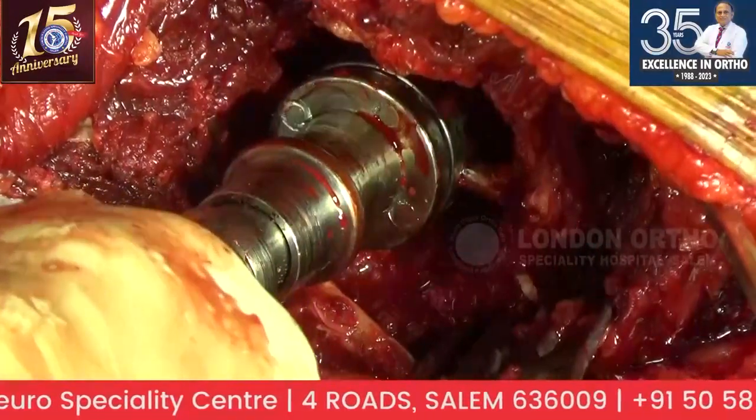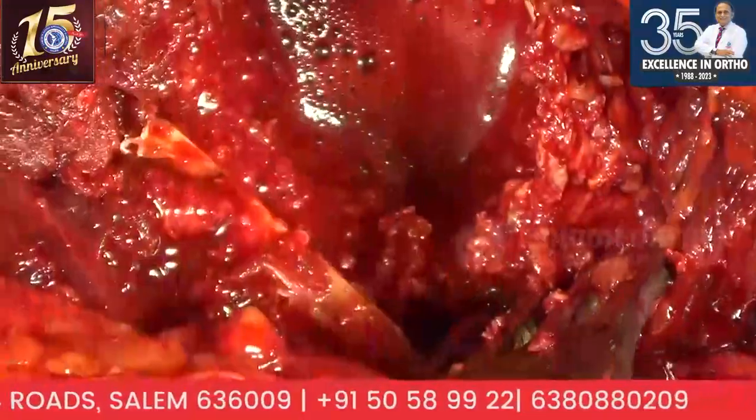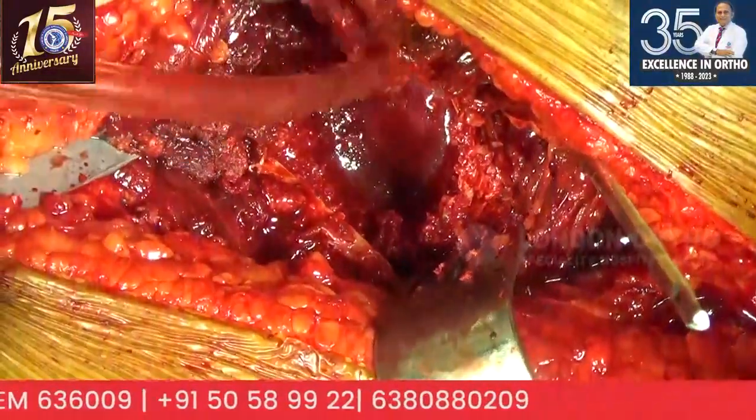You cannot lateralize it. It's poor biomechanics. Yeah, poor, and high failure rates with the lateralization. High failure rates. Wash.